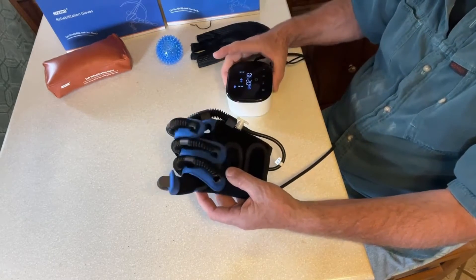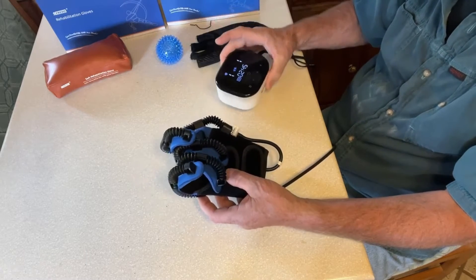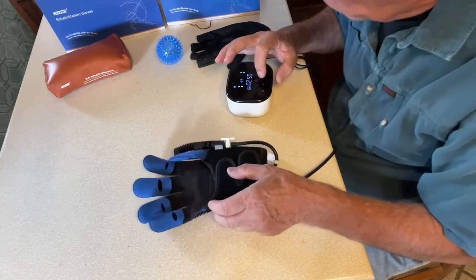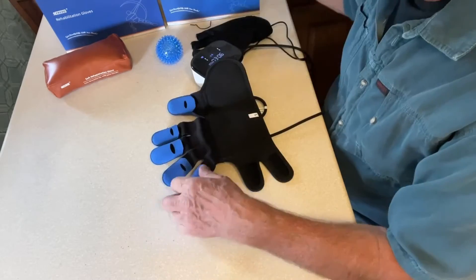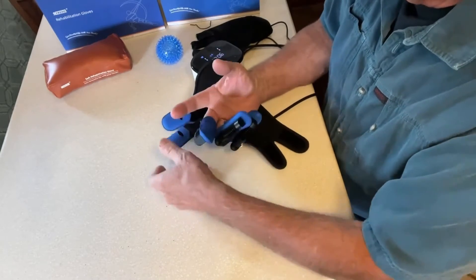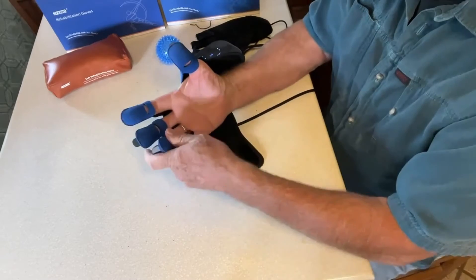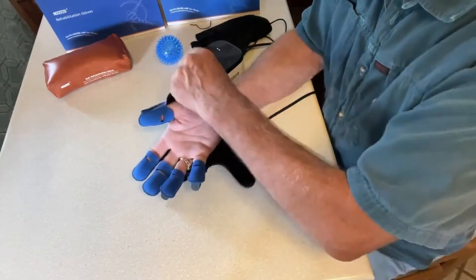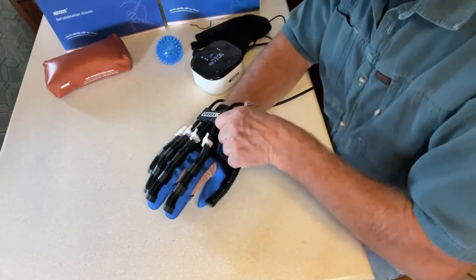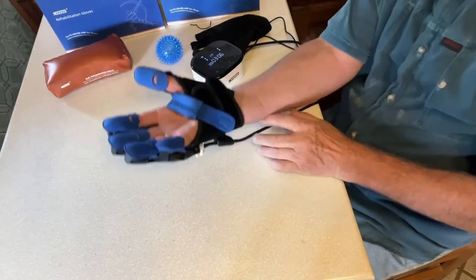The interval of how long it stays open or closed is set on the host. Let me put it on and we'll see what I think it feels like. This is a large — they come in different sizes. I've always thought of my hands as being medium, but it fits good. This goes over your wrist, and there's a thing on the back that comes over and holds it.